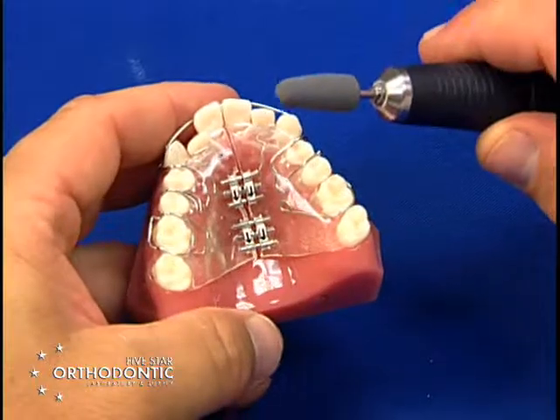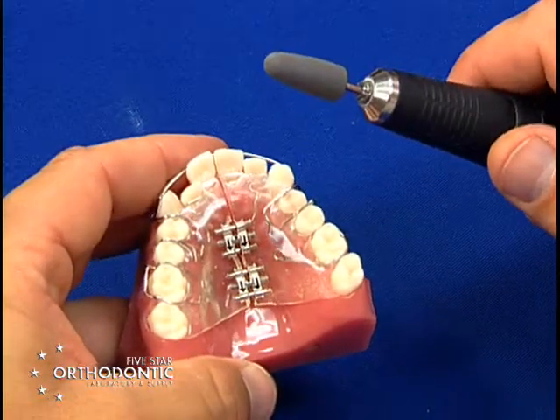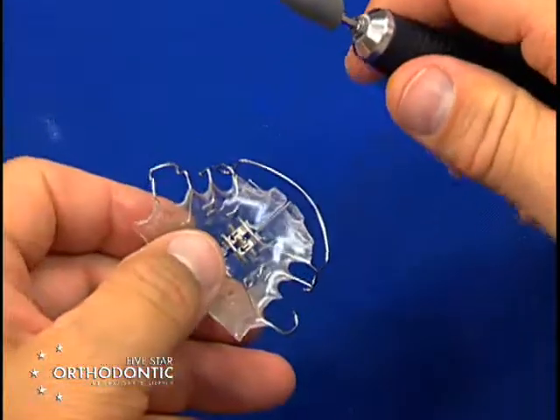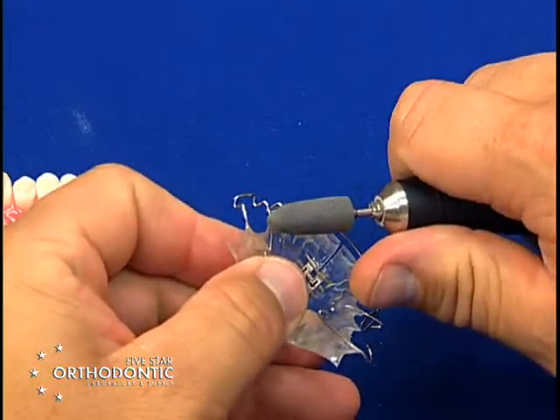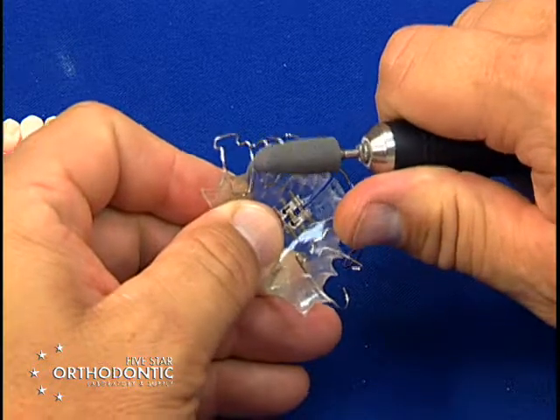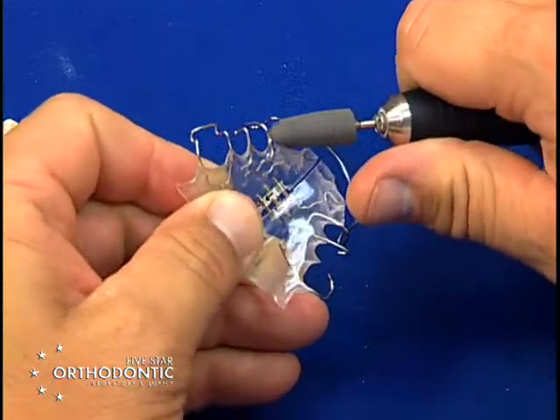You can take a polishing burr such as this on the handpiece, just use a lab handpiece, take the appliance off, and you can take this acrylic polishing burr and just go around the metal clasp to get any occlusal interferences out of the way.